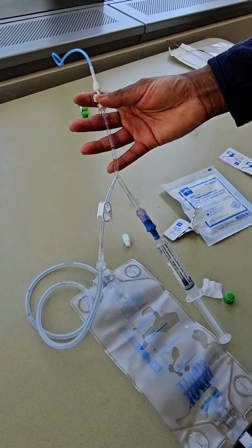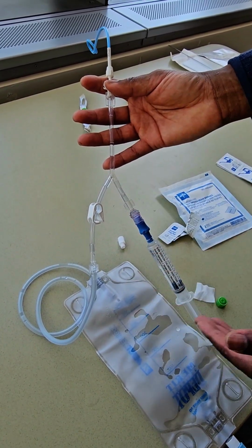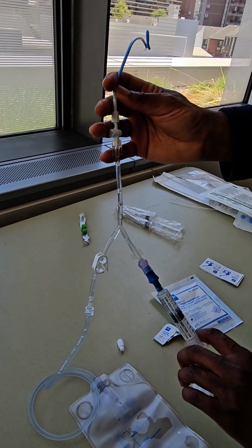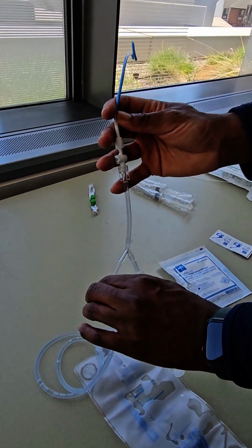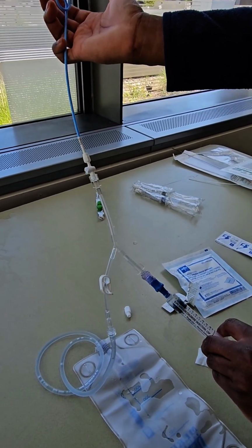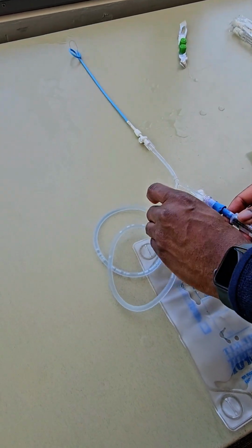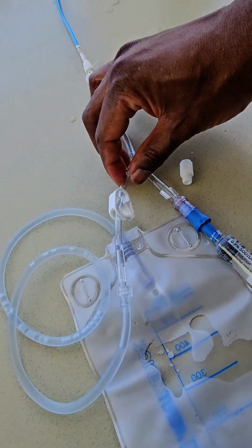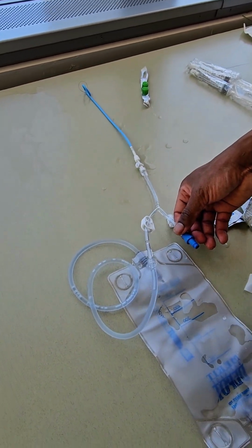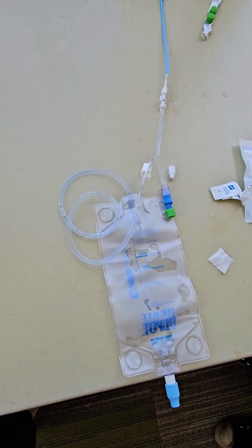And like I said before, the path of least resistance is into the bag as long as the clamp is open. And so when I flush with the syringe here, for example, most of the fluid should go into the bag, and that's how the patient will flush into the bag. And then if I clamp this now, the path of least resistance is into the patient. And so when I flush here, the saline will go into the patient, and that's how the patient will flush into their system. One thing to remember is to make sure that you unclamp this after you flush it so that the patient can drain normally. And then once that's done, you can take off the saline syringe, and then you can wipe it if you want. And then if it came with a green cap, you can place a green cap over it.